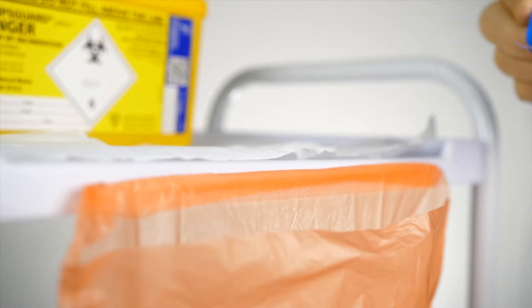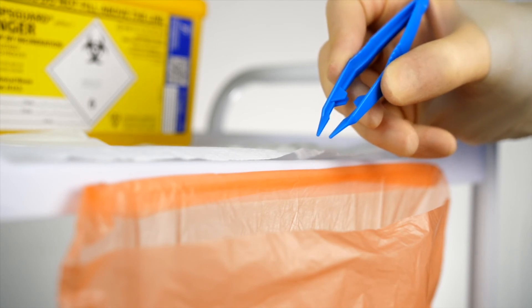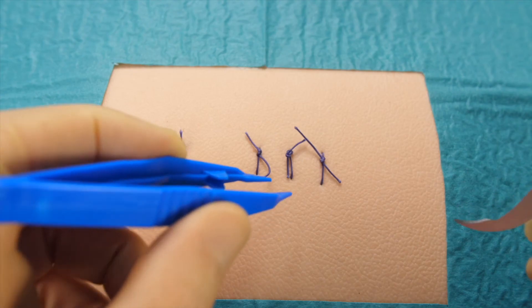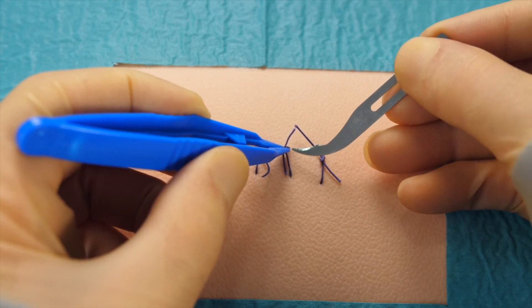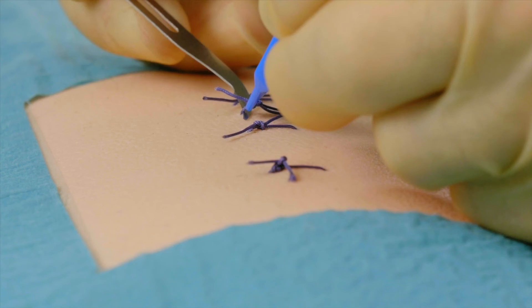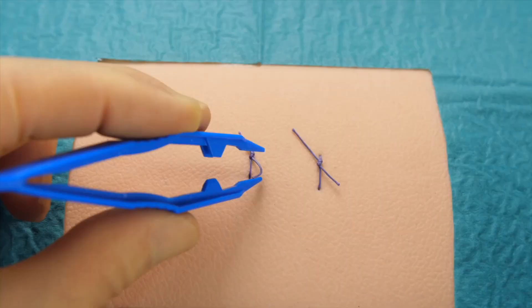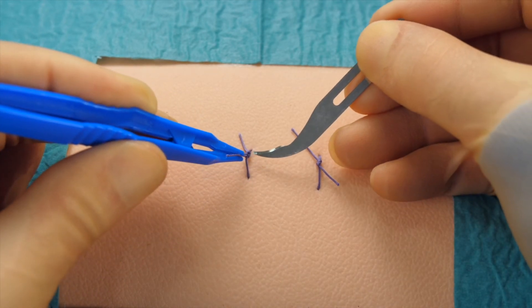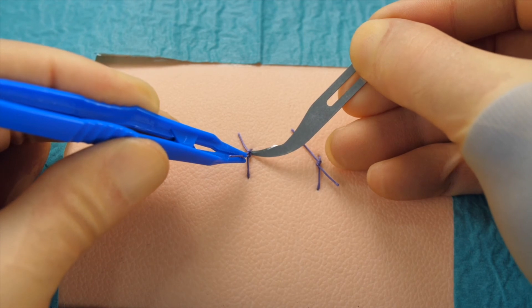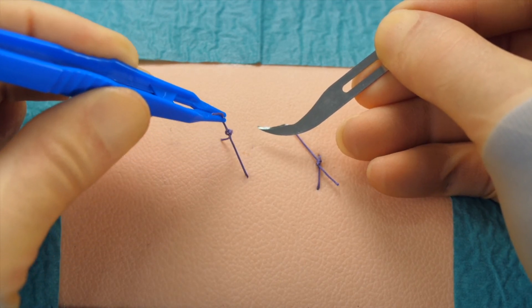Having removed the suture, we then place it within the clinical waste disposal bag. The process is then repeated for the rest of the sutures, which are removed in exactly the same manner until all of the sutures have been successfully removed. Note that we do not pull the suture away from the wound — instead, we always pull it gently across the wound. Otherwise, this would risk potentially opening up the wound and causing dehiscence.